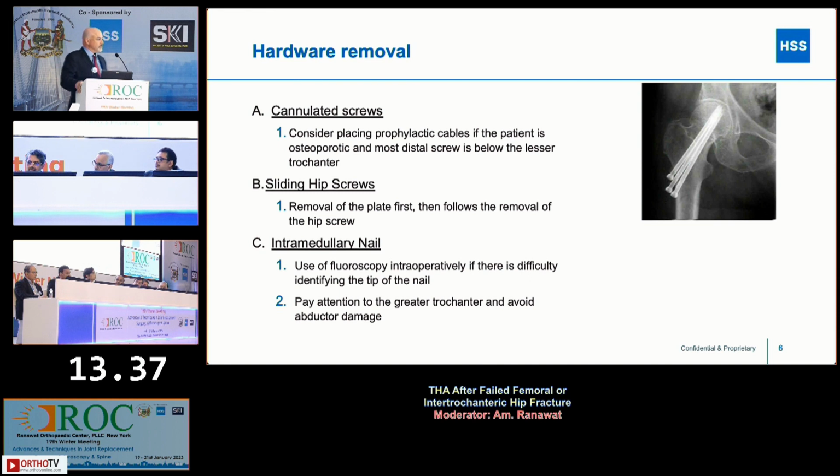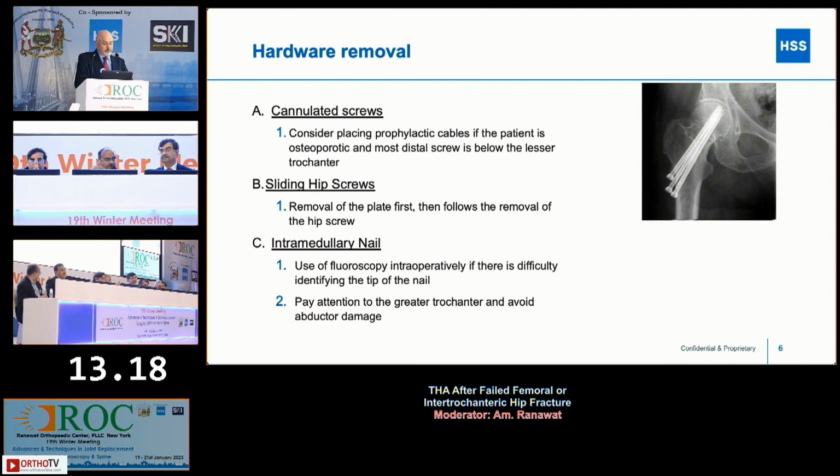Or else you could do cemented. You can do that too, but then you're really playing the flute, trying to hold all those. Cemented stem, cement will come out of the holes, that's the other part. Yeah, and that's a more bad-looking X-ray, but that's not too much of a problem. You anyway are doing the burring in order to put your broach in. But sometimes, in the case of older patients, when there is porotic bone, I prefer a standard cemented stem which will block all the holes. I don't have to put a longer stem.